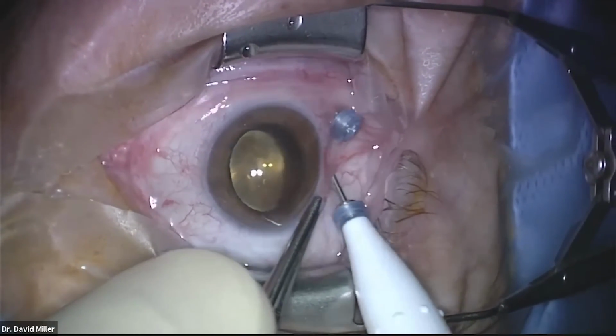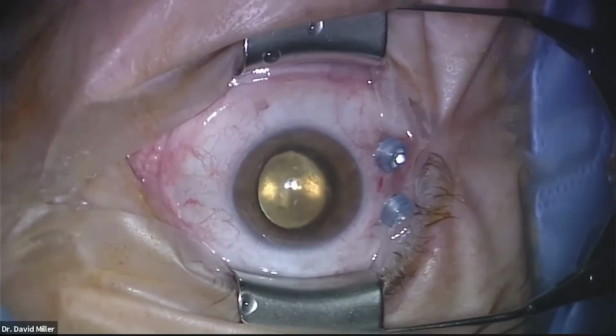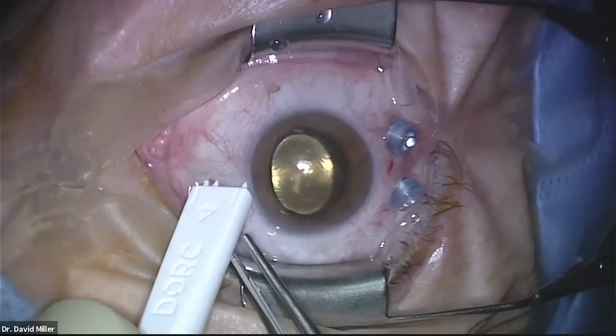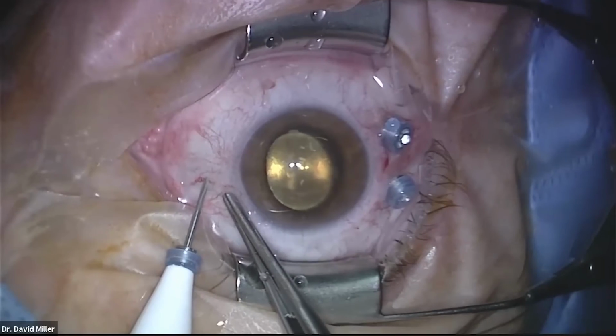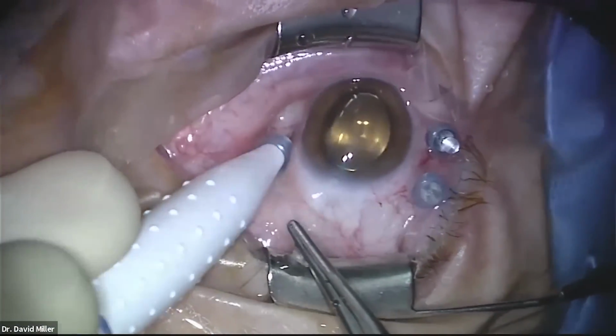There we go. How we doing there? All righty, you're doing fine by our end. We avoid the old wounds, which are typically more commonly higher. But if you know where you go, try to go somewhere a little different. If you hit the old wounds, it's a little tougher to close the eye. They tend to leak more.